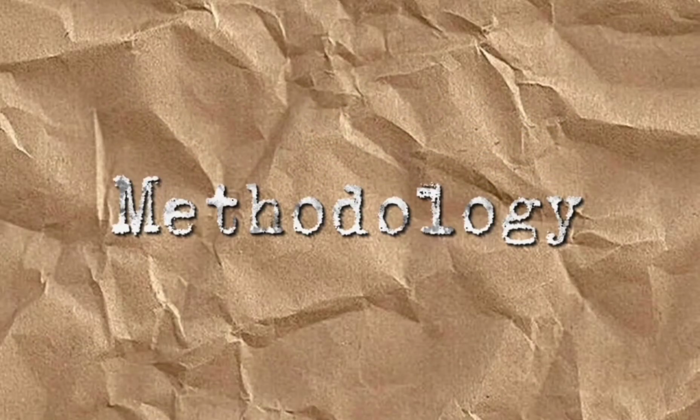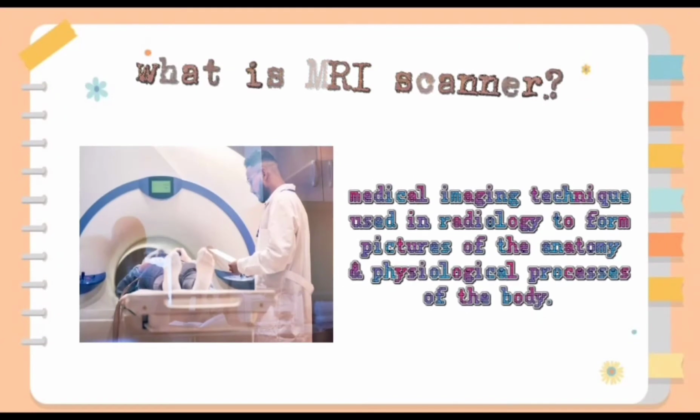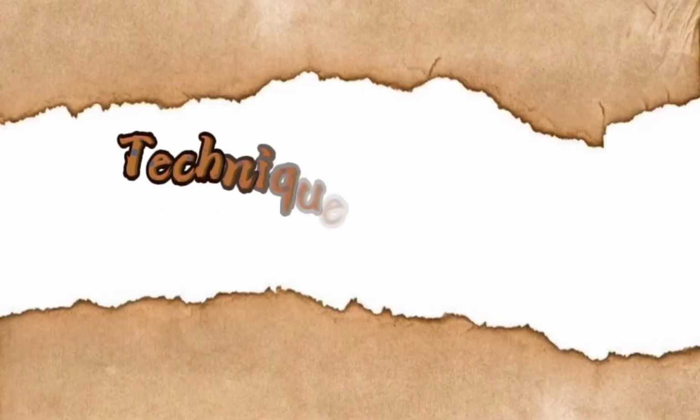Methodology. What is an MRI scanner? It is a medical imaging technique used in radiology to form pictures of the anatomy and physiological processes of the body. Technique of MRI.